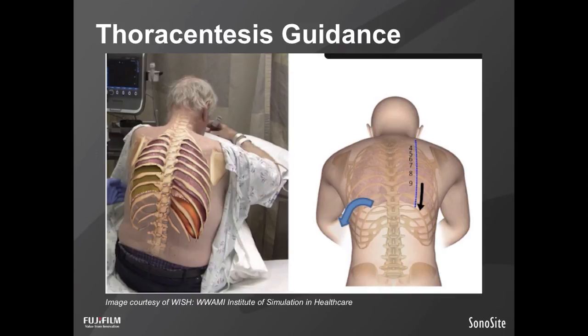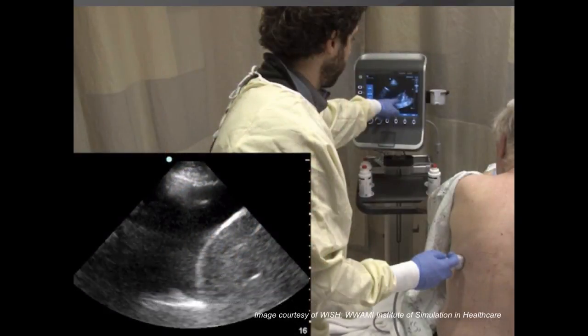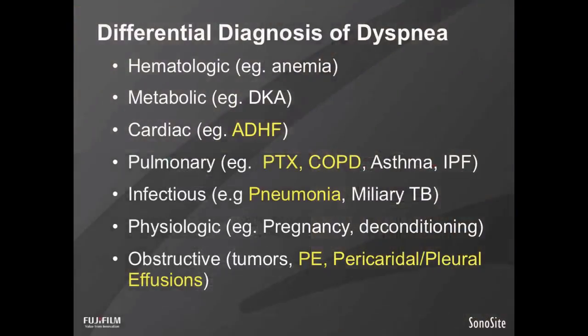So ultrasound can be used to locate the diaphragm, which can actually be very elevated in someone with a TB effusion because they often have coexistent ascites from disseminated TB, and it can help you choose a rib space that is just above it for maximal drainage. So watching the ultrasound through the different respiratory cycles of the patient helps the clinician determine the safest puncture site with respect to the diaphragmatic movement. And remember, post-procedure, don't forget to look for pneumothorax and lung sliding to make sure a complication did not occur.